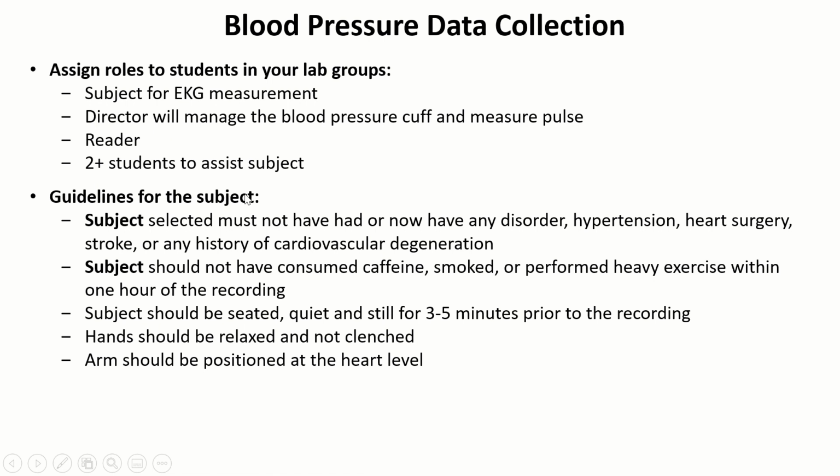The guidelines for the subject is that they must not have had any disorder, hypertension, heart surgery, stroke, or any history of cardiovascular degeneration for any of these exercises. It's best if they've not consumed caffeine, smoked, or performed heavy exercise within 1 hour of the recording.